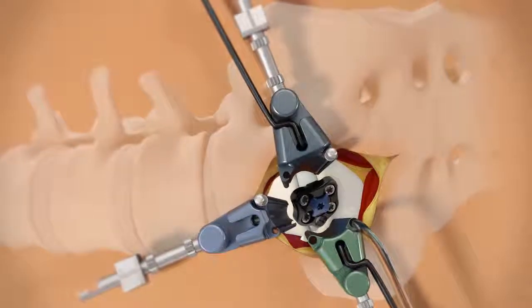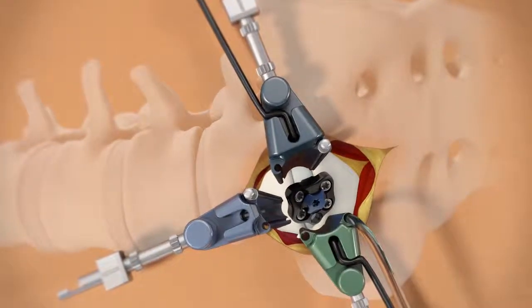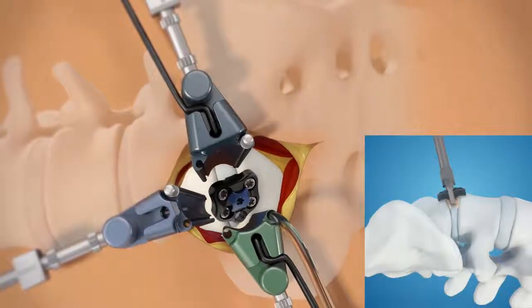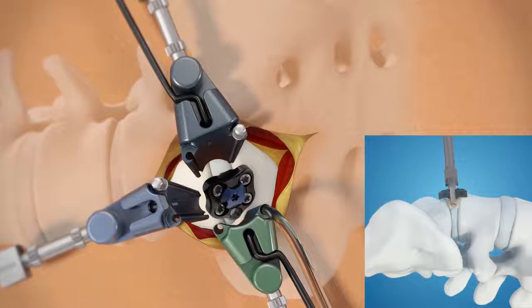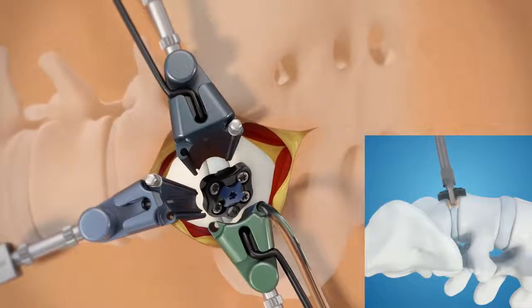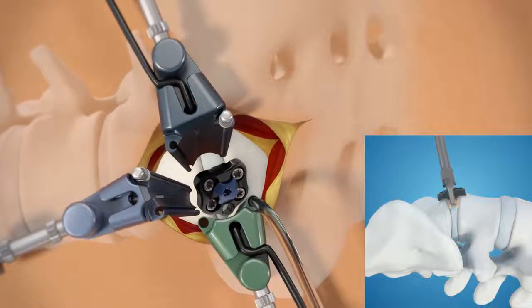A plate can be added for fixation with no need to reposition the patient to insert posterior pedicle screws. The Divergence L anterior oblique lumbar fusion system allows the interbody spacer and plate to be inserted together from an entirely oblique trajectory.